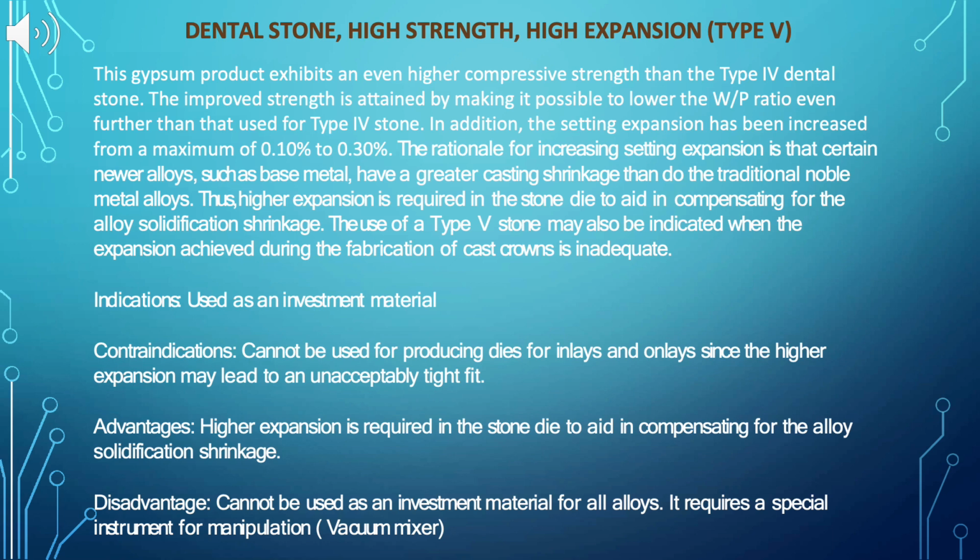Disadvantage: cannot be used as an investment material for all alloys. It requires a special instrument for manipulation, vacuum mixer.